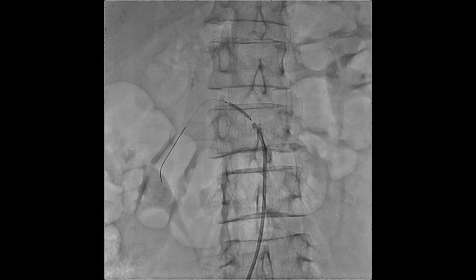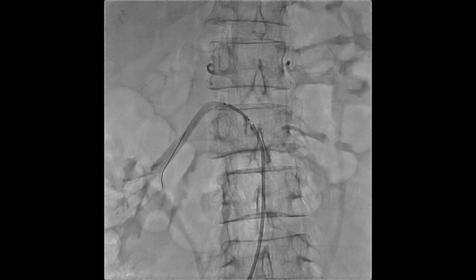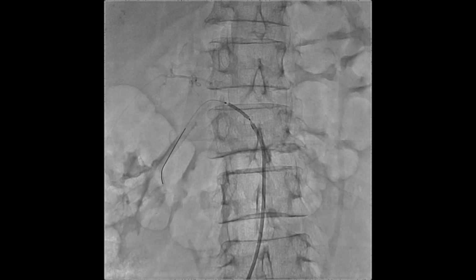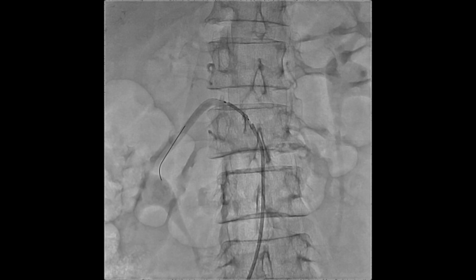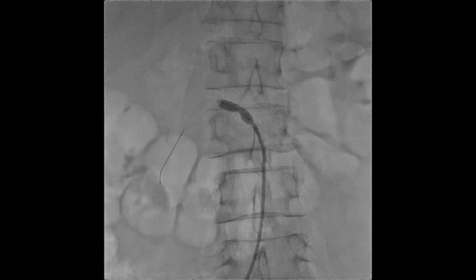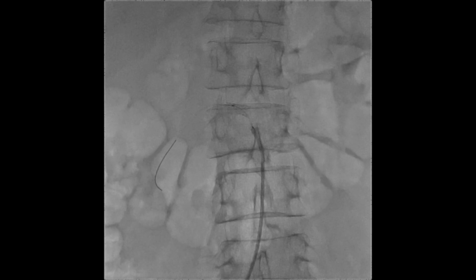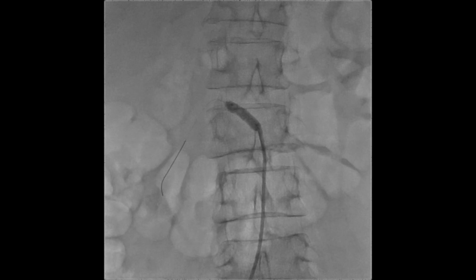This is Herculink 6 by 15 millimeter stent from Abbott Vascular. So this is the inflation. So you can see that balloon expandable stents usually in diameters of 5 to 7 millimeter, and as I explained, lengths of 8 to 20 millimeter or 16, 18 millimeters are commonly used. The proximal stent may have to extend back into the aorta by 1 to 2 millimeter to achieve full circumferential coverage of the renal ostium. Self-expanding stents have been used to treat mid-segment lesions but are not recommended for ostial or proximal renal artery lesions. Next, we flare the ostial portion of the stent at high pressure with the same stent balloon.